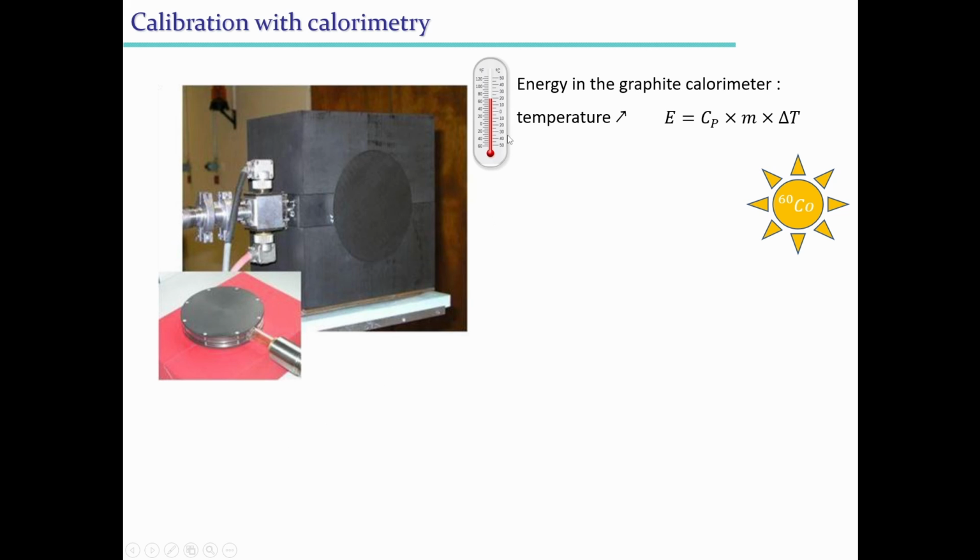You know that when irradiating some piece of equipment, it will rise its temperature even by a very tiny amount. But if you are accurate enough, you will take this rise in temperature as a very precise measurement of the energy being injected into the element. And you've got the same constant as before here, so you have to take into account the graphite constant.